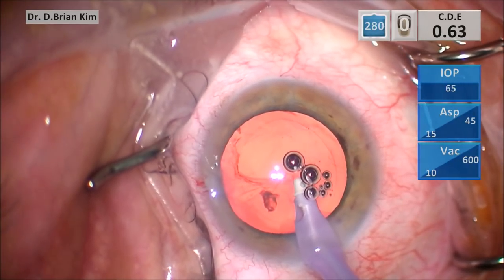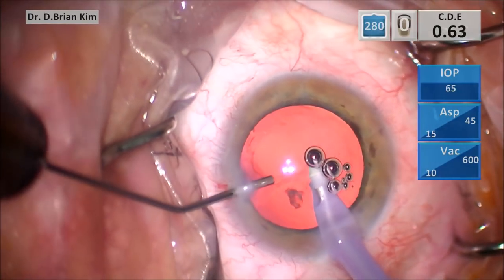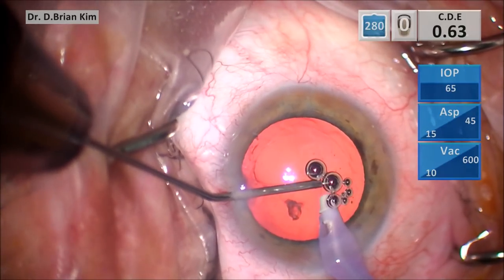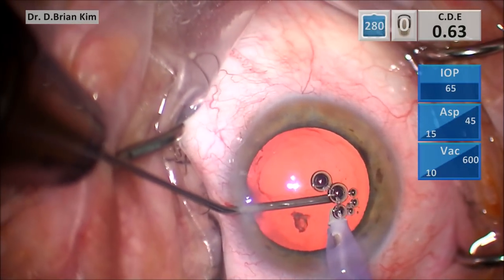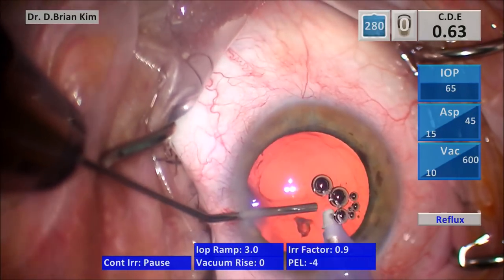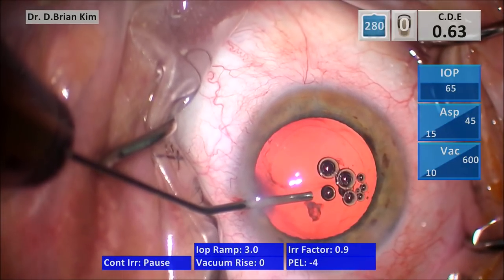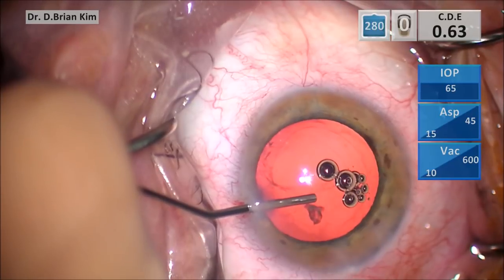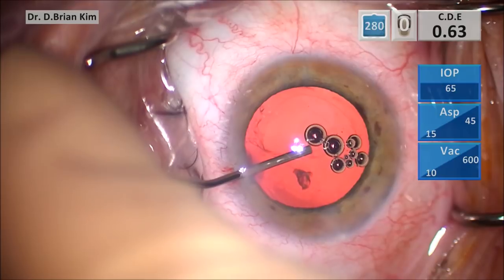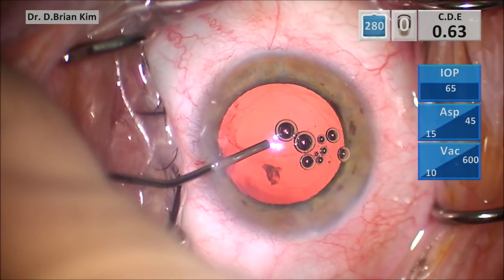And I'm just holding irrigation at this point. I'm going to use my dispersive viscoelastic cannula to try to tease that vitreous off of the port. You could reflux at this point, but you might reflux a bunch of lens material into the eye, but I go ahead and do it now. As you can see, that lens material came out, but thankfully it was at the edge of the incision. So now I'm going to push some dispersive gently to push that vitreous back and expand the eye a little bit with the viscoelastic.